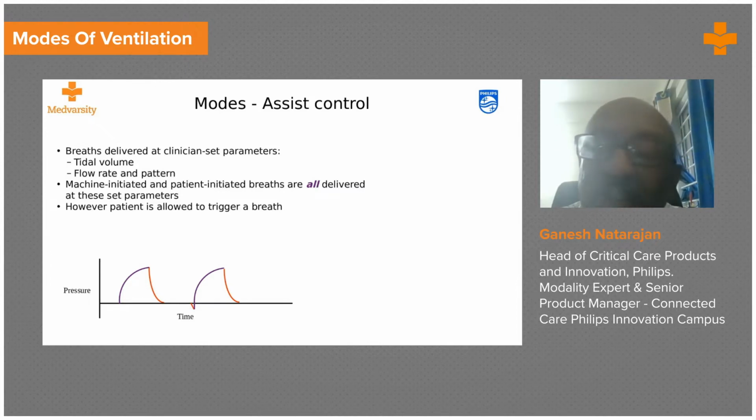Is this concept clear? I'll actually pause here for 30 seconds to wait for any questions. I'm seeing it on my chat window. I don't see any questions as of now, but I'll pause here because understanding the assist control and understanding why many physicians today prefer to start ventilation with assist control is important.